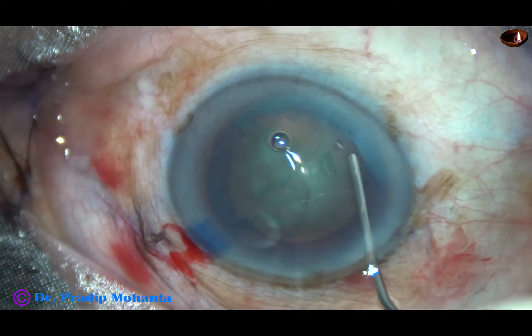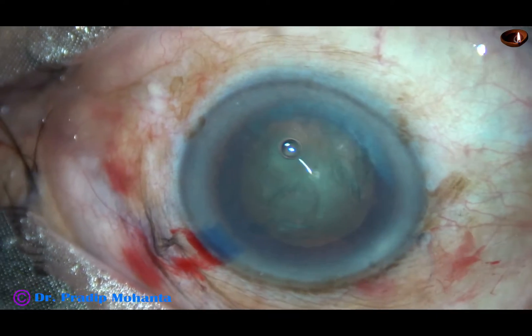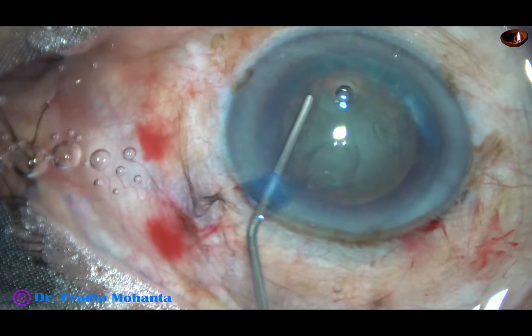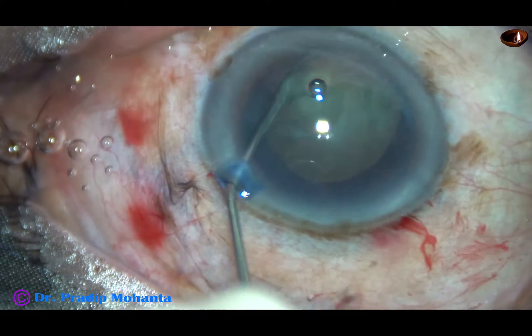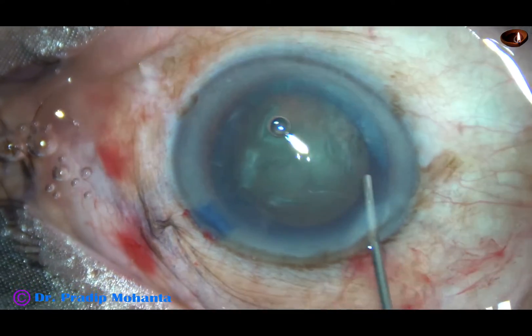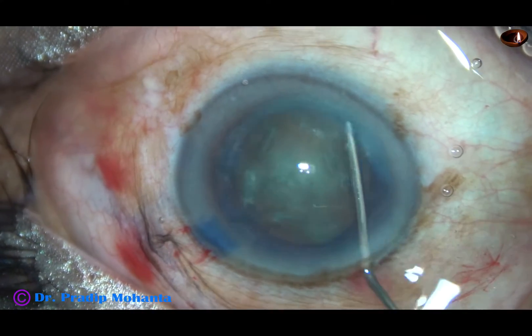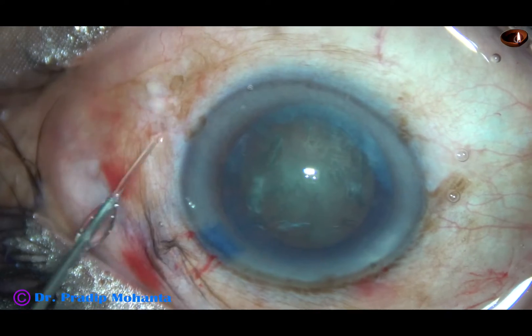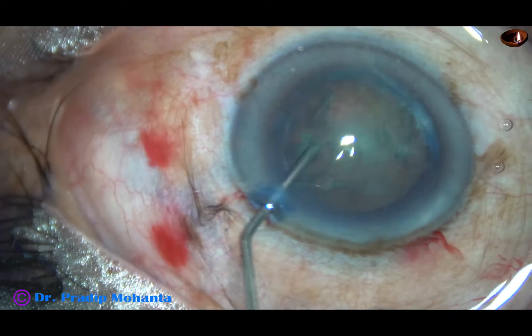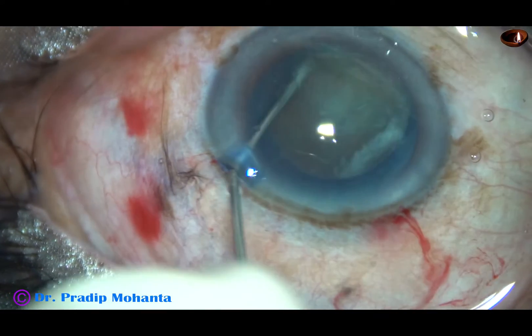Now hydrodissection. Hydrodissection is being done very gently. Small amounts of fluid are being injected at multiple points. The nucleus did not rotate, so some more hydrodissection, some more injection of fluid is done. And then the nucleus rotates.